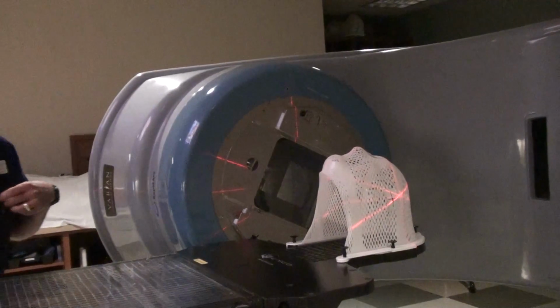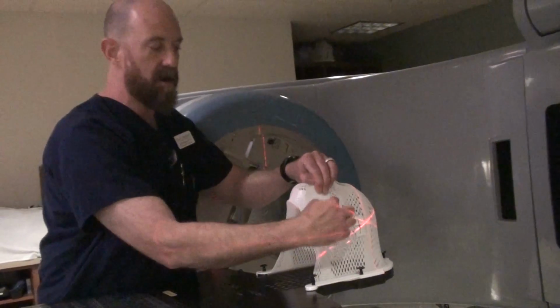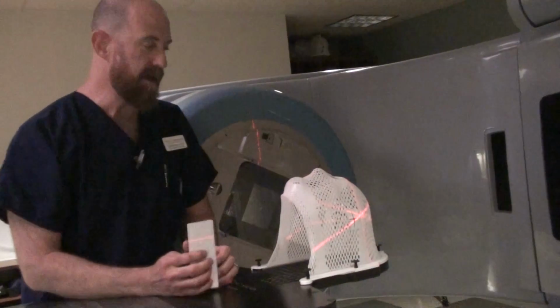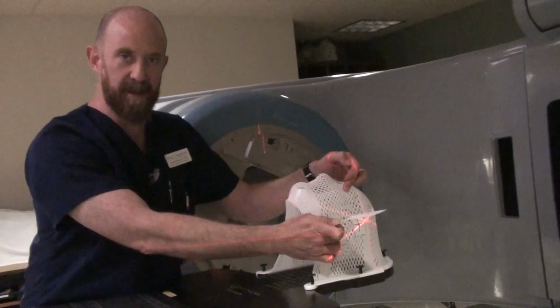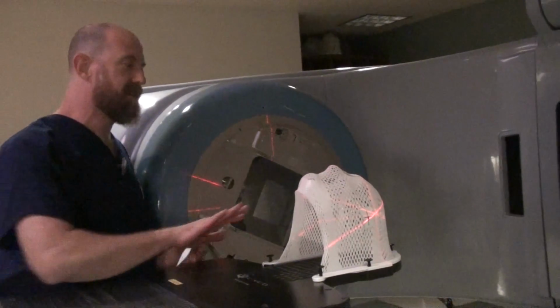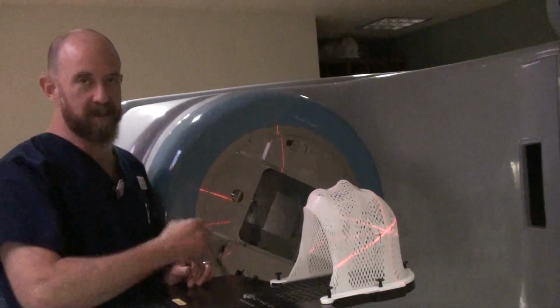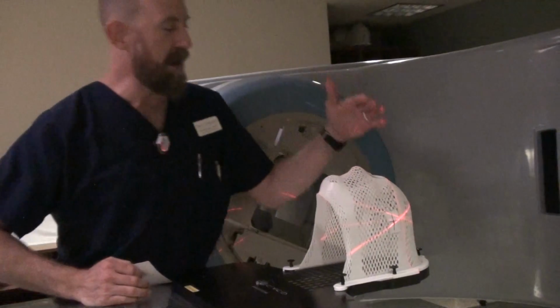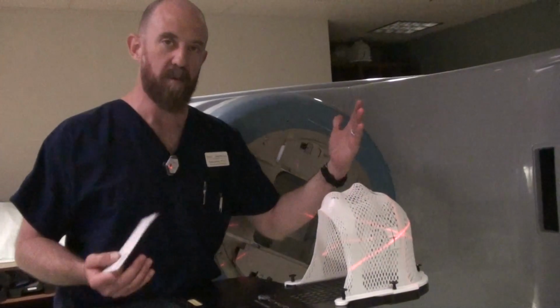So, again, borders. Your inferior field will kind of be angled like this, or it'll be square with a block to block the eyes, facial area, just so you're treating only the brain case. Okay, so your inferior field will extend from outer canthus to either mastoid tip or EAM. All of your other borders will be flash. What is flash? Flash is when the radiation field itself goes around an object out into space without being blocked or absorbed by either the patient or a block. So flash means that you actually have the field size larger in this particular case than the rest of the head. So all of your other borders will be 1 to 2 centimeters of flash.